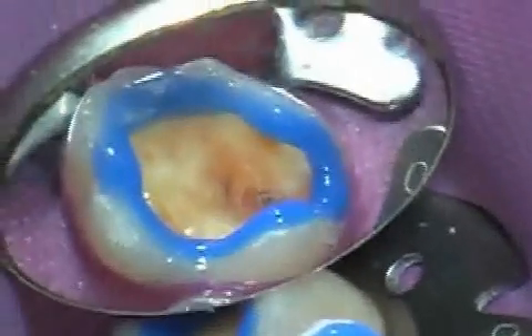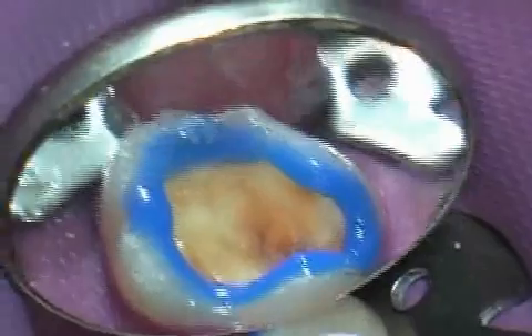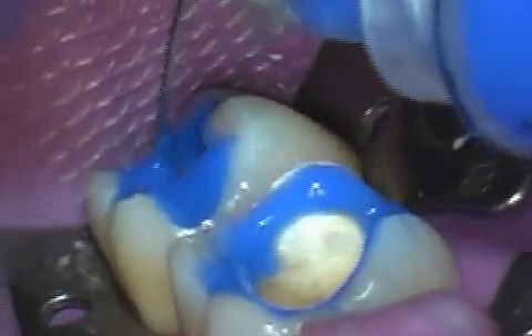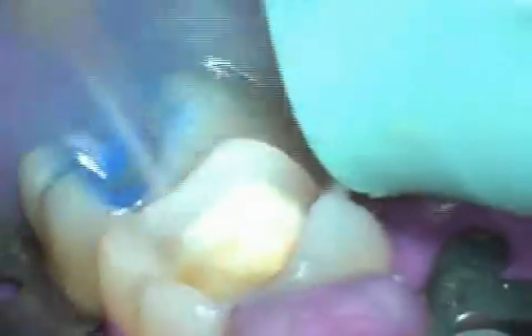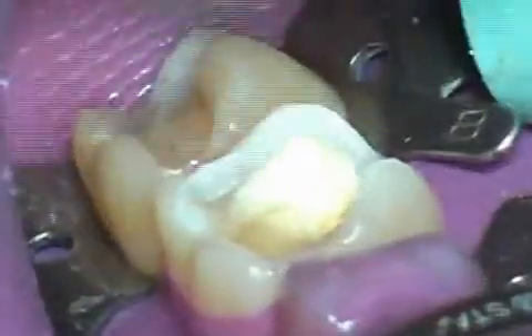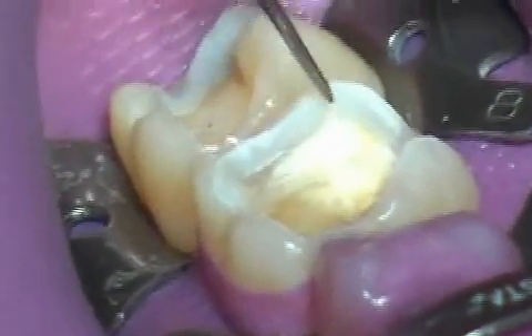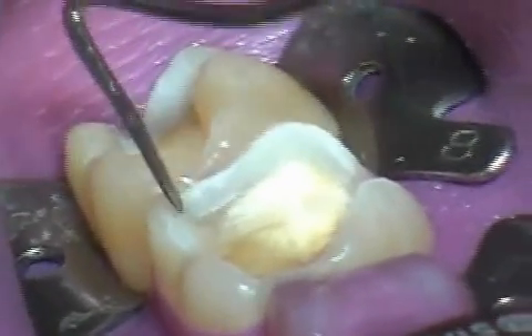You can see the dentist checking the work using a mirror. The discolorations in the dentine are from an old amalgam filling and do not need to be removed. The rest of the tooth is now treated with etching gel. The tooth is cleansed thoroughly with water and then dried. The enamel, the dentist points to it with a probe, now looks chalky white — a sign that the work was performed correctly.